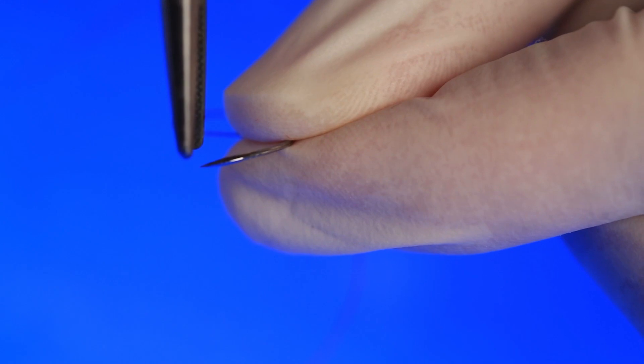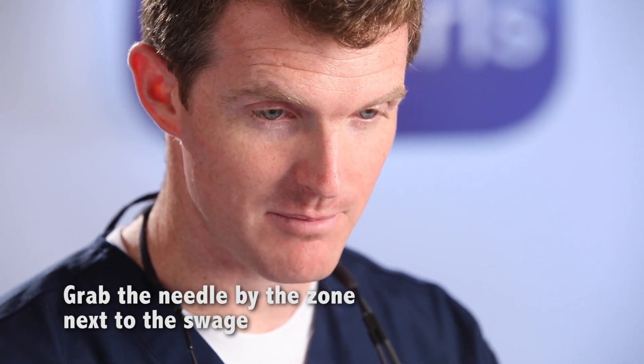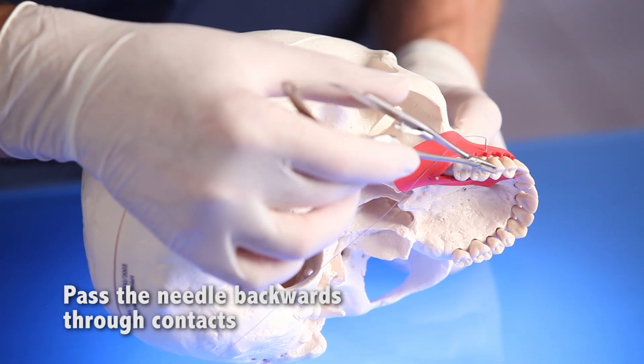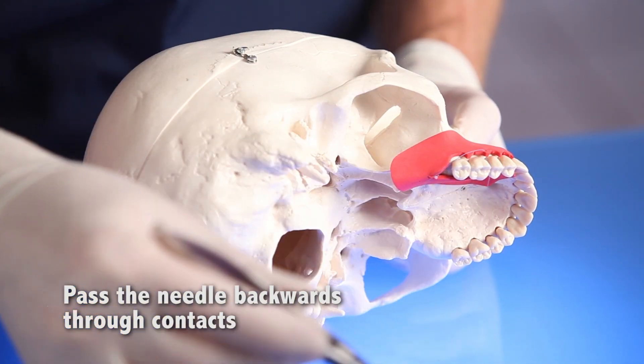Number three, don't grab the needle by the tip. Don't grab it by the swage. Grab the needle by the area beyond the swage. Number four, pass the needle back end first when passing interproximally.